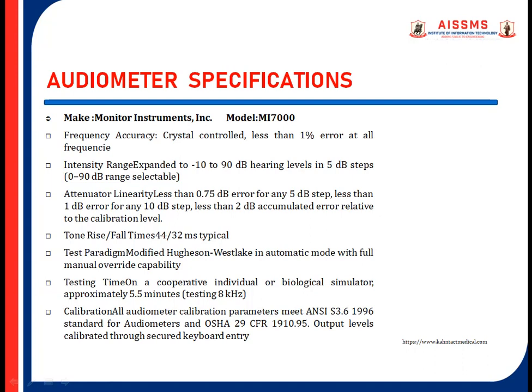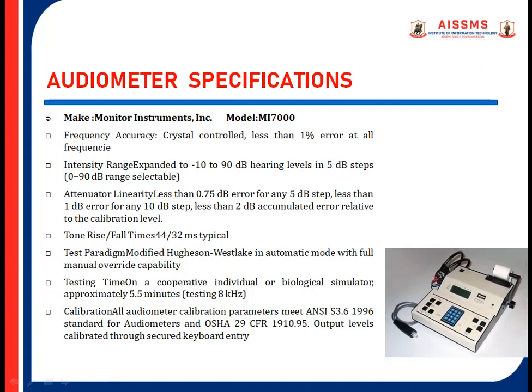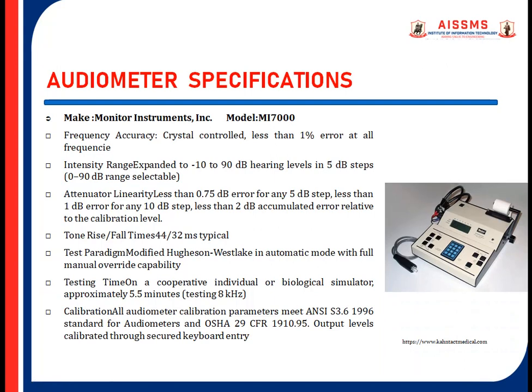Audiometer specifications. Monitor instrument make model number MI7000 having the listed specifications.